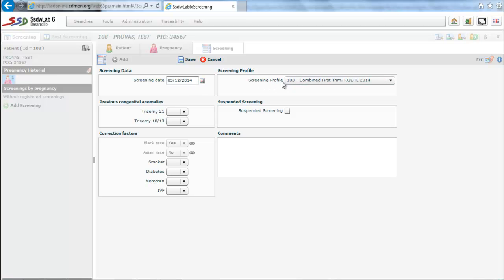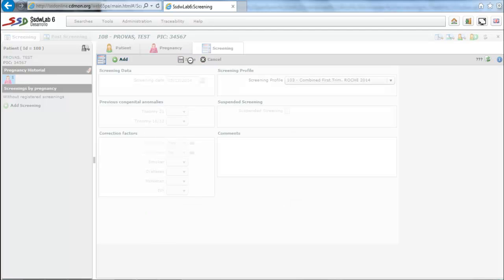We choose a combined first trimester screening profile, which comes by default. We note that there is a section regarding previous anomalies and another that refers to the correction factors. We can observe the black race is marked as we have previously defined.